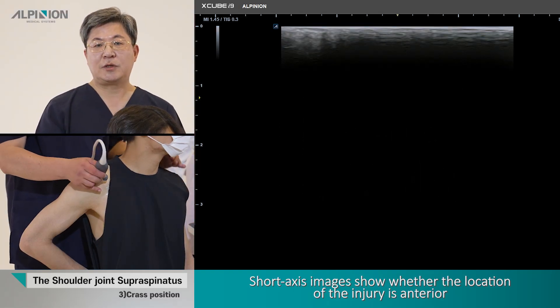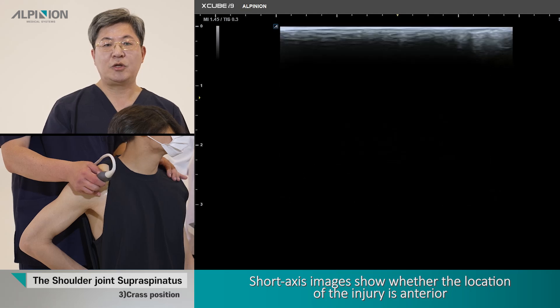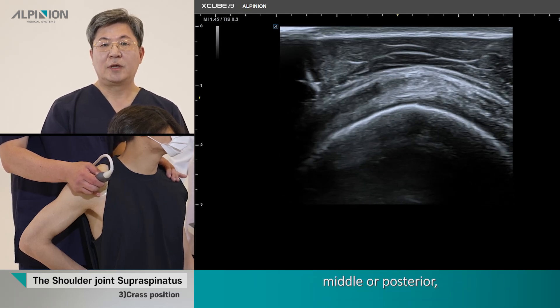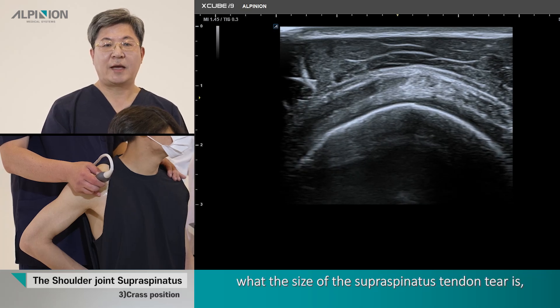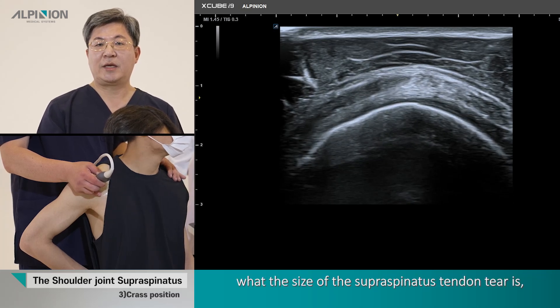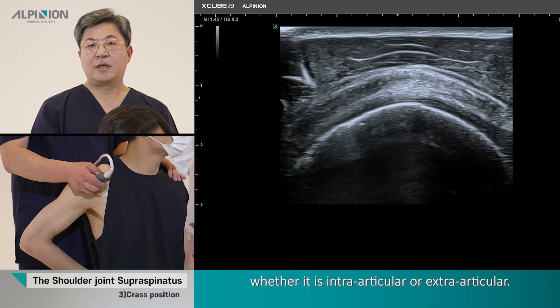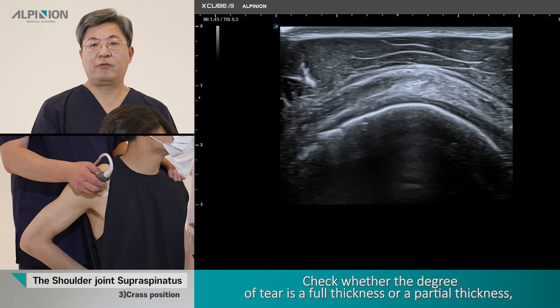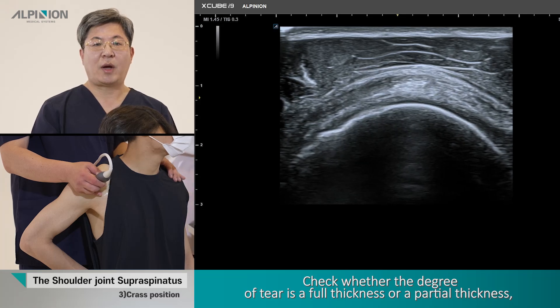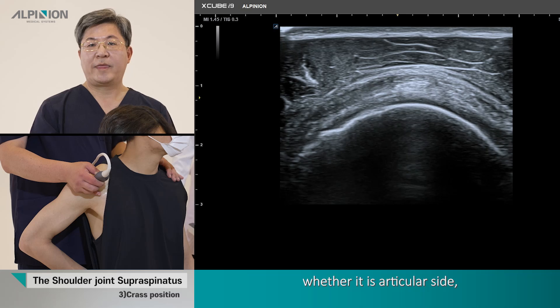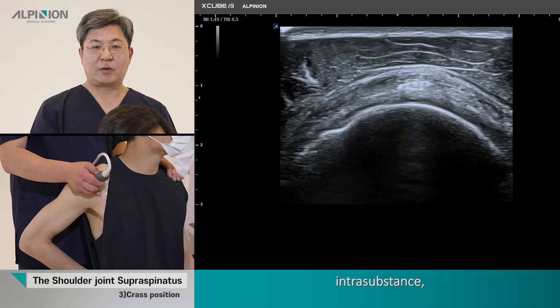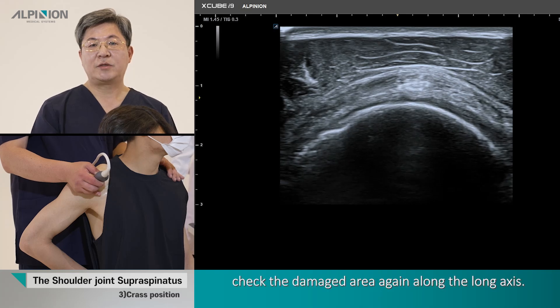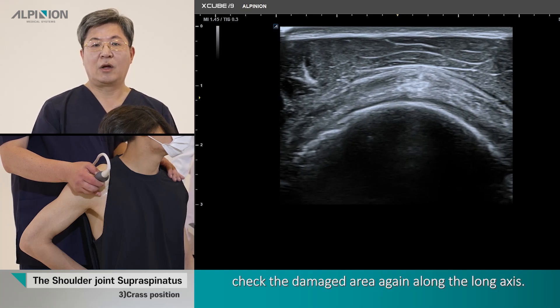The short axis image shows whether the location of the injury is anterior, middle, or posterior. If there is a tear, assess the size of the supraspinous tendon tear, and whether it is intraarticular or extraarticular. Check whether the degree of the tear is full thickness or partial thickness, and furthermore, whether it is on the articular side, intra-substance, or bursal side. Then check the damaged area again along the long axis.